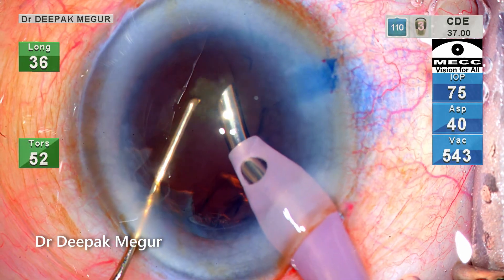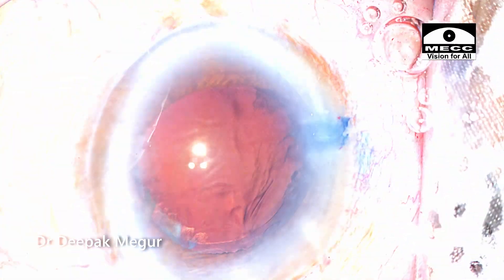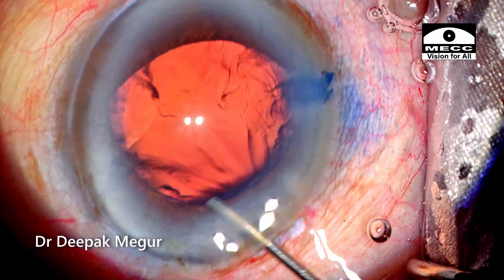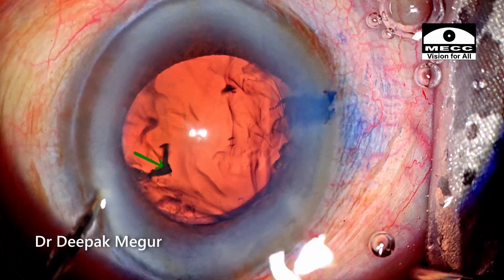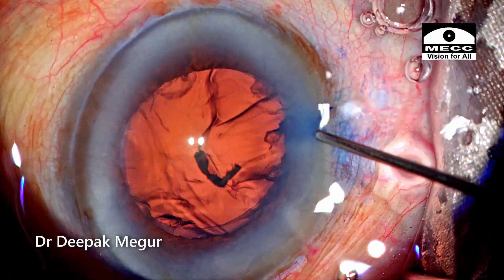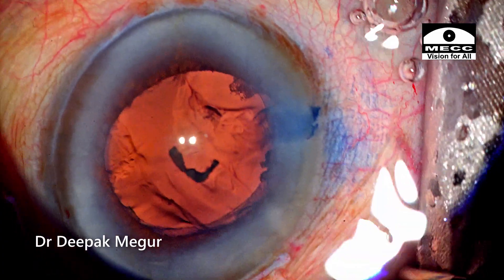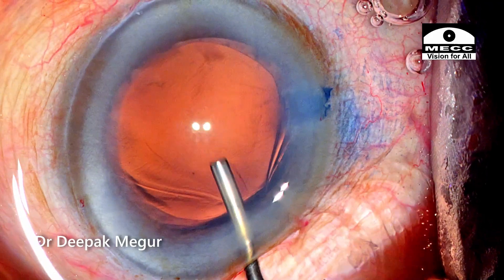The emulsification process is now completed. As a habit, I always use some fluid from the side ports since usually some fragments and lens fibers get stuck there. It is important not to miss these tiny lens particles, which can cause chronic recurrent uveitis in the late postoperative period. The two tiny fragments are flushed out using OVD.